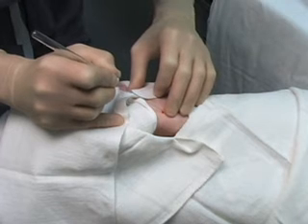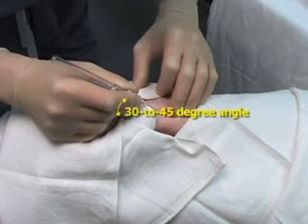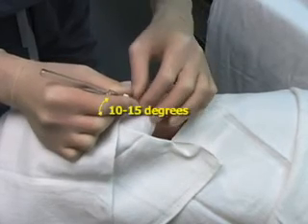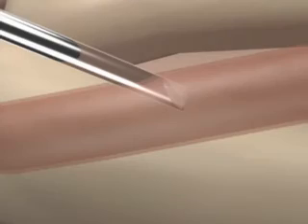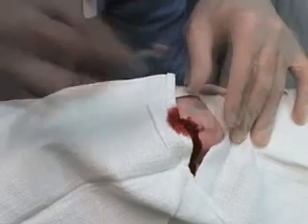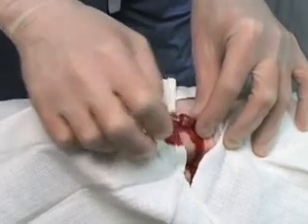In the over-the-needle technique, a catheter is used and advanced at a similar 30 to 45-degree angle. Once blood return is obtained, the needle is advanced slightly farther to assure that the catheter has entered the vessel. The needle angle is then lowered to 10 to 15 degrees, and the catheter is advanced into the vessel. Proximal pressure is applied to the artery, and the needle can then be removed and the catheter can be connected to the transducer system.